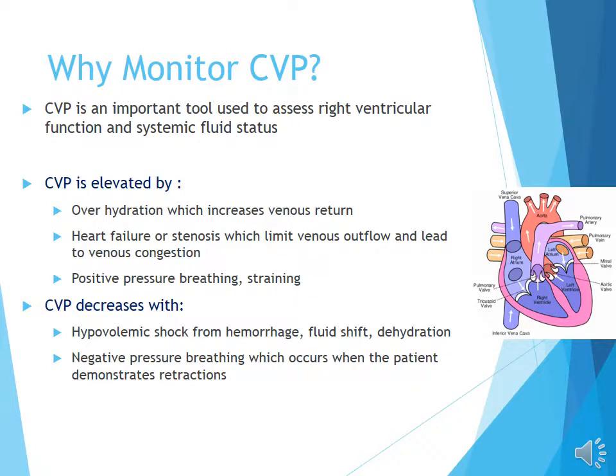Why do we monitor CVP? It's a really great tool to assess right ventricular function and also for fluid status. So that's why they want to monitor them a lot, to guide treatment. With surgical patients, heart failure patients is another good one. Shock patients, they monitor a lot.